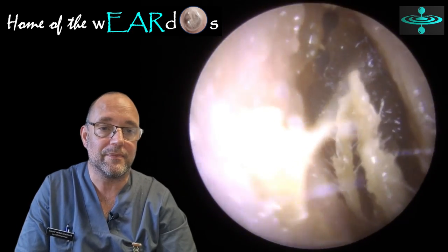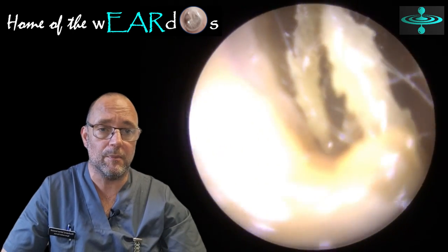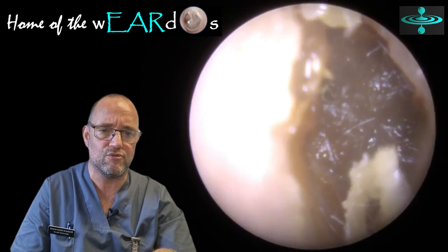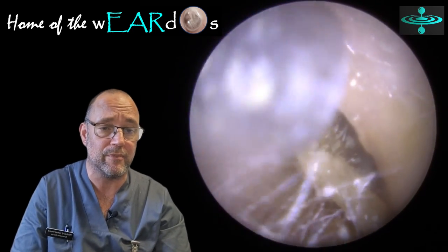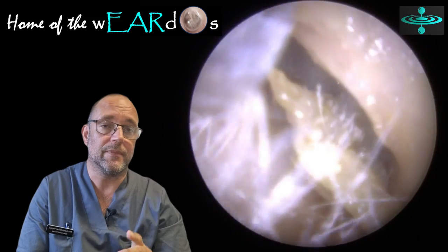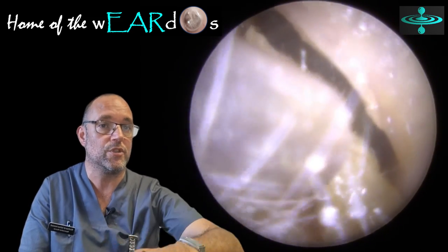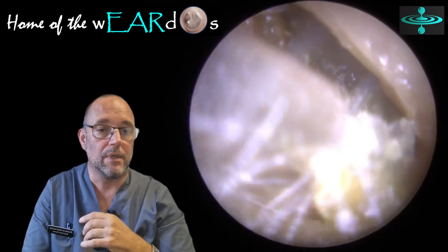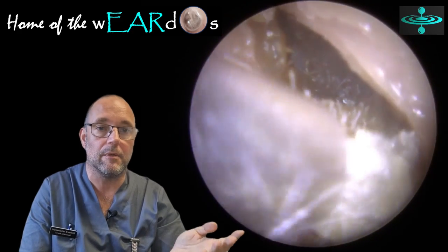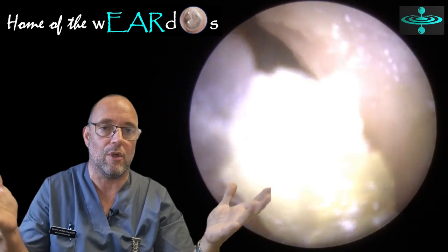Now, bane of my life, these things. You've just seen them — two very different ears from the same person. The second one is extremely narrow. They were both really difficult, but for very different reasons. The first one — have a guess what caused it. You could see it kind of smushed, you could see an indentation in it. Yes, it's the trusty cotton bud, or the Q-tip as you Americans call it. It's bud-shaped and it's made out of cotton. It's a cotton bud.